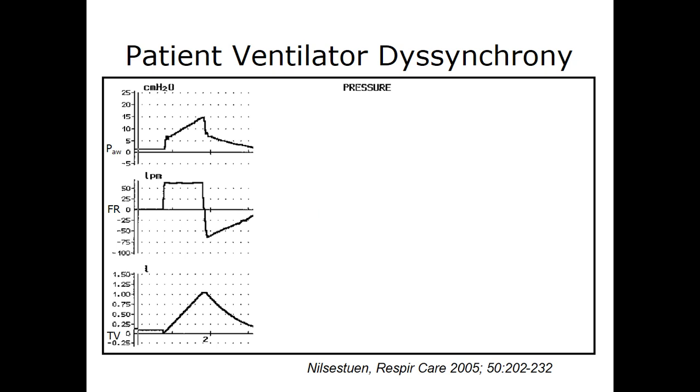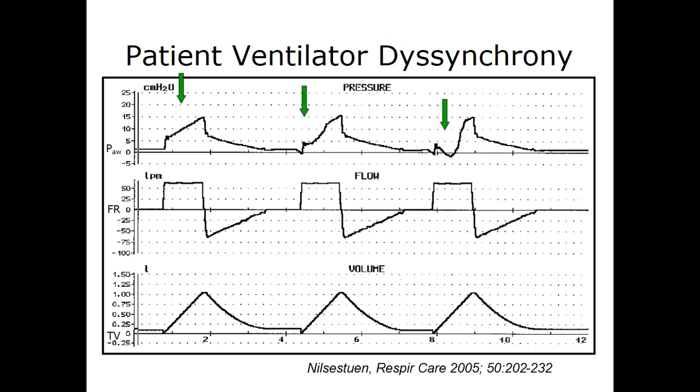It would go down. If the patient's breathing in, this airway pressure is going to be sucked down negatively. And so when you see this pattern on the airway pressure versus time curve, where the airway pressure isn't going up nice and smoothly like it should, but instead is getting sucked downward, that means the patient is activating the respiratory muscles throughout the inspiratory cycle, which generally is not what we want. We want to rest the patient.